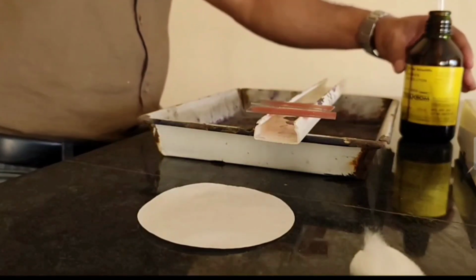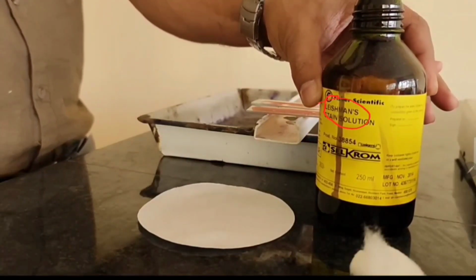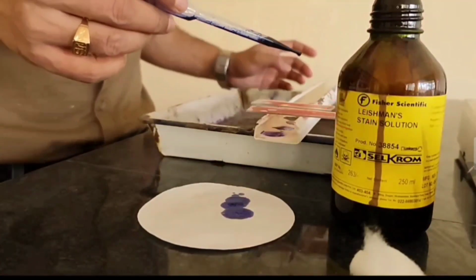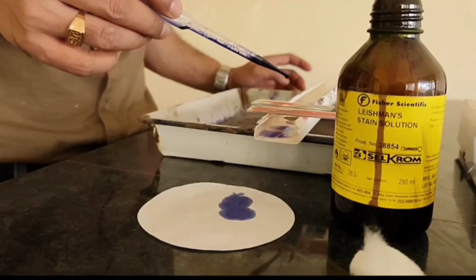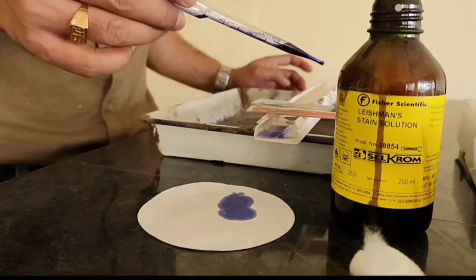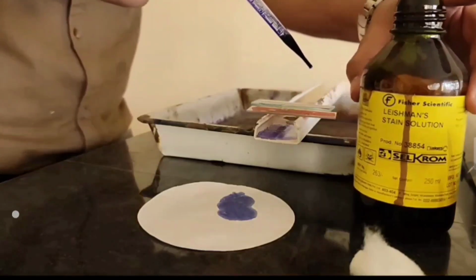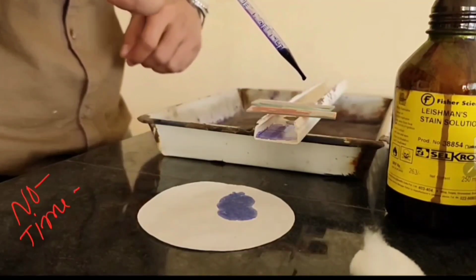Here we can put Leishman stain. So see, this is a Leishman solution, and you must know the composition, so please read about the composition and function of each and every component of Leishman stain. So I am putting Leishman stain, 1 2 3 4 5 6, and count the number. We should always count the number of drops, and timing is important. Both the number of drops and timing are important.